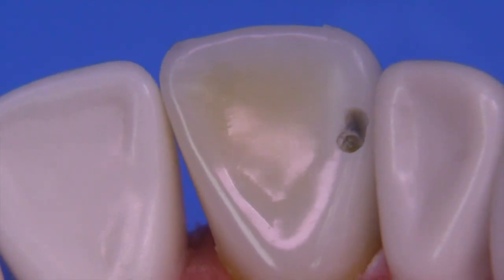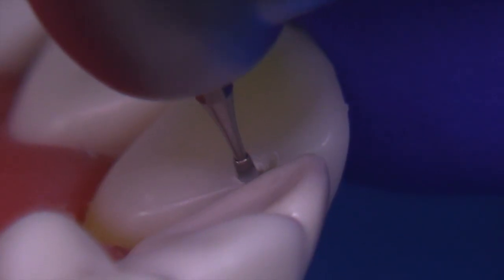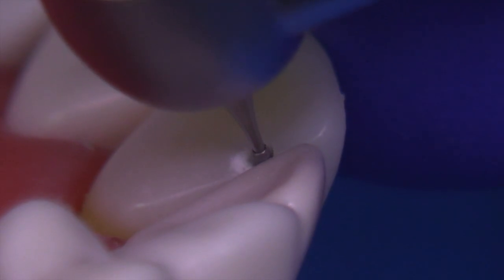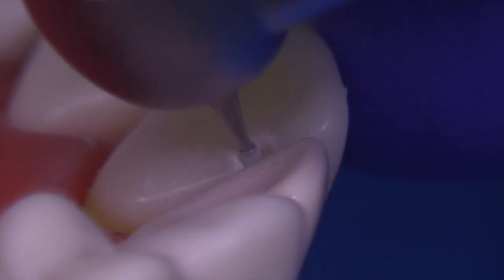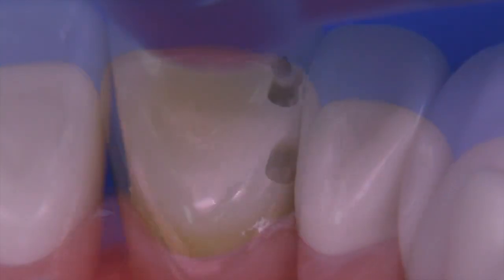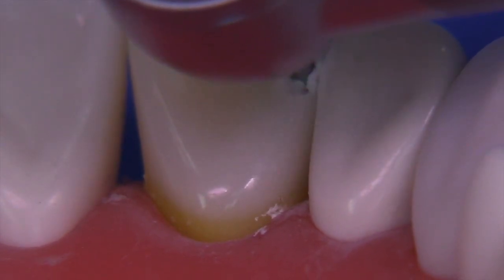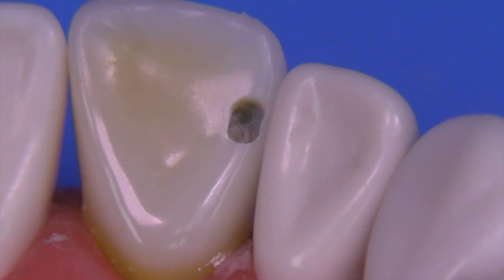You can see the caries clearly present inside the preparation at this stage. We want to make sure we remove all of the decay — not just the colored material, but also the soft material — so you'll need to use both your visual and tactile senses. Don't worry about going the entire length of the 330 diamond; you'll need to go further to extend beyond the decay and break the contact to the level needed. The decay goes rather deep axially, toward the mesial, so your box doesn't need to be narrow mesiodistally — you can open it up without worrying about going too far axially.